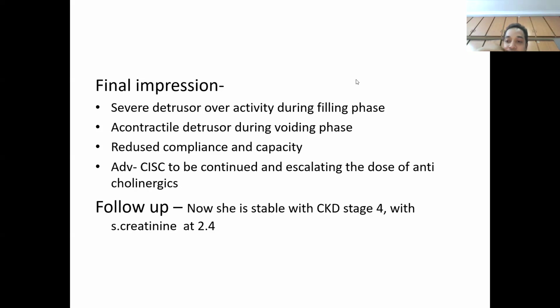So does that mean that we need to do this UDS also at that time itself? Yes. Even so, especially children are very vulnerable. All guidelines recommend urodynamics to be done as soon as the child recovers from the spine surgery. Children are particularly vulnerable. And we have a long list of children. Literally every 10 days, I see one child where just 6 months or 1 year at the time of birth is enough for chronic kidney disease to set in.